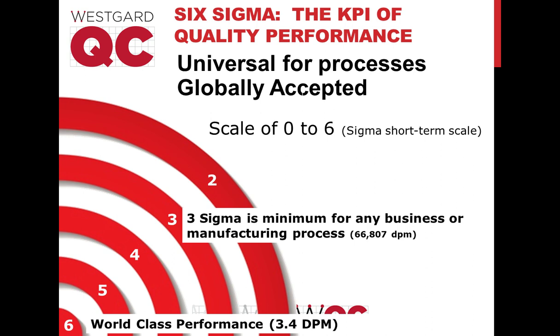But essentially, it helps you adjust the clinician's expectations about how to handle those results. So if you have a low-performing assay, you'll be telling the clinician, you need to wait for a big change before you think something has happened with a patient. You can actually flag between serial results. You can say the difference between the last result on this patient and this result is not big enough for you to think there's a clinical change. It's just noise. It's just the difference from day to day. So don't make a medical decision on that particular result.